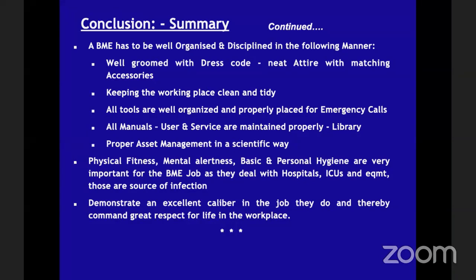It's gone. So the people have to be educated properly as to which call has to be attended first. And if he has particular tools, open the cupboard, take the test equipment or the toolkit, and run to the emergency. So these have to be well organized.